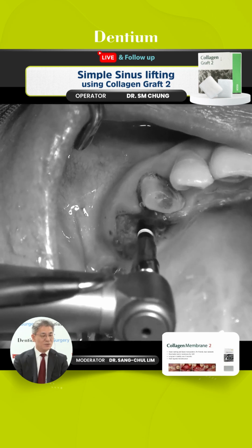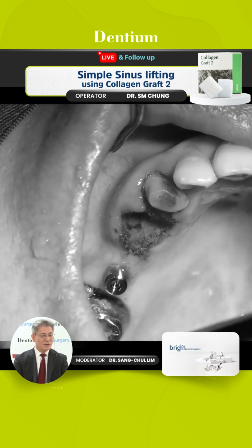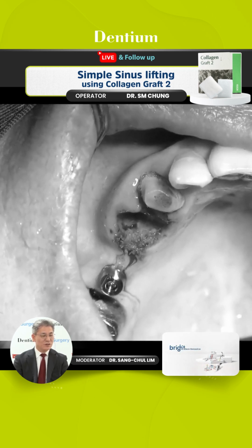And that is the key procedure and key role of this compaction drill.